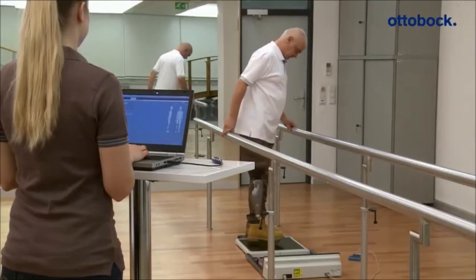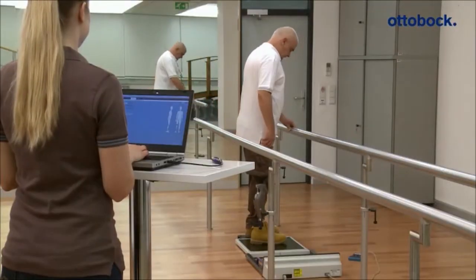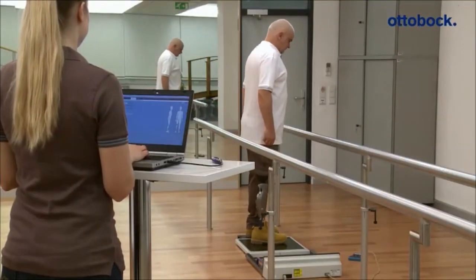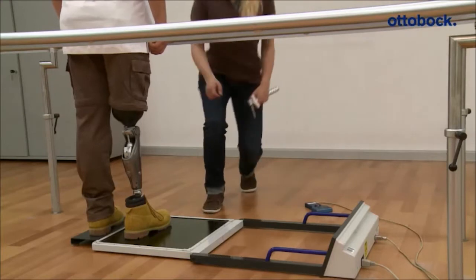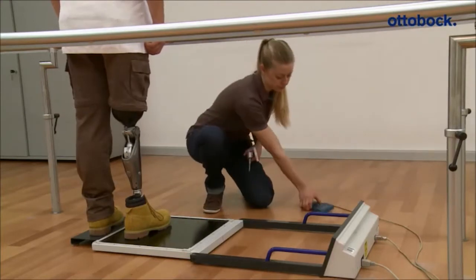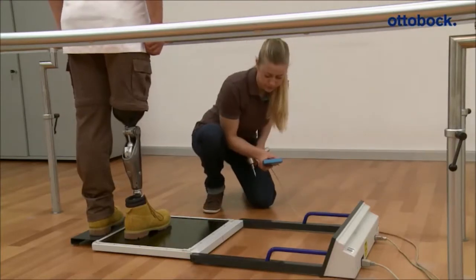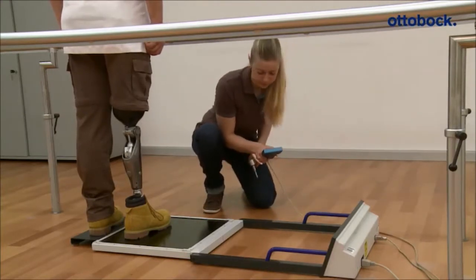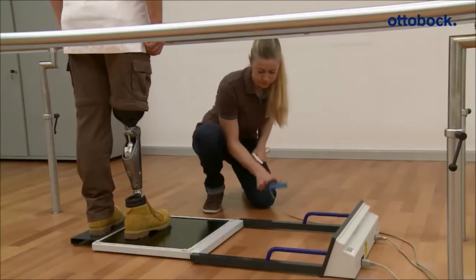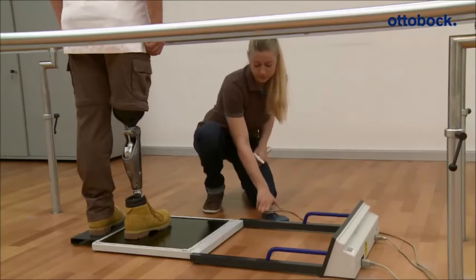The knee joint has to be calibrated in the standing position before the user walks with the prosthesis for the first time. This ensures that the knee joint works in a safe manner from the very start.